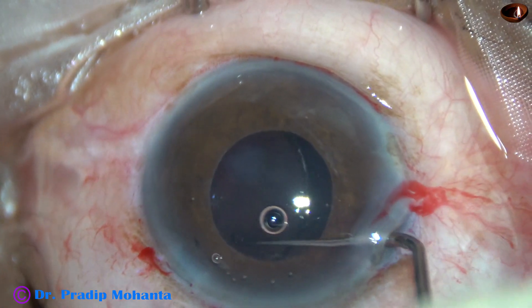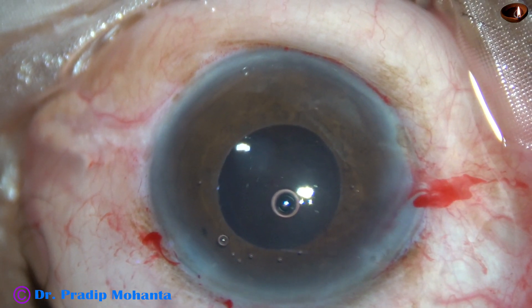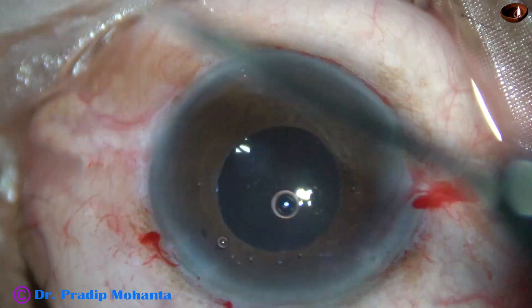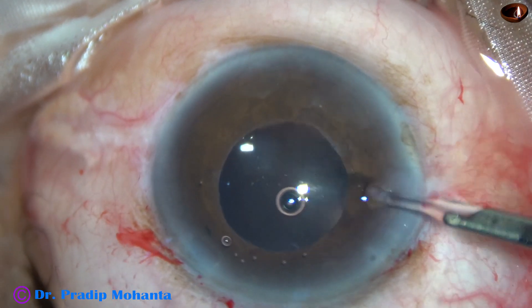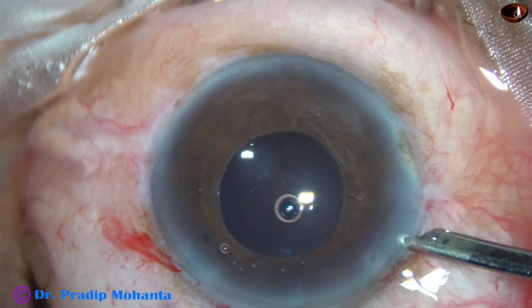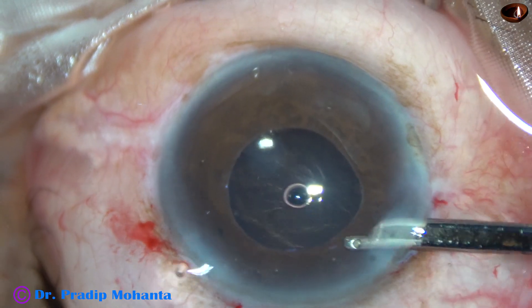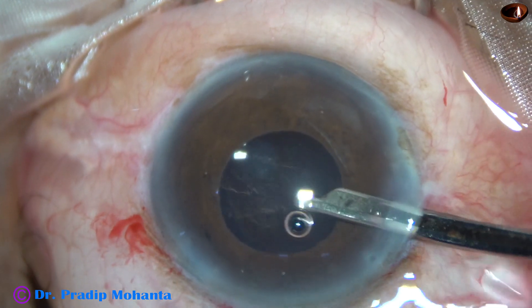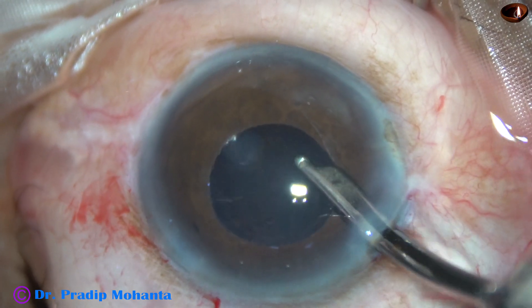But in this case, I didn't feel that the zonule is so weak. Now, once the lens is in the capsular bag, the next thing is to clean the viscoelastic both from the anterior chamber as well as from the capsular bag thoroughly.